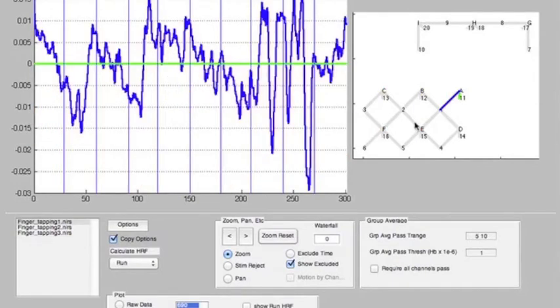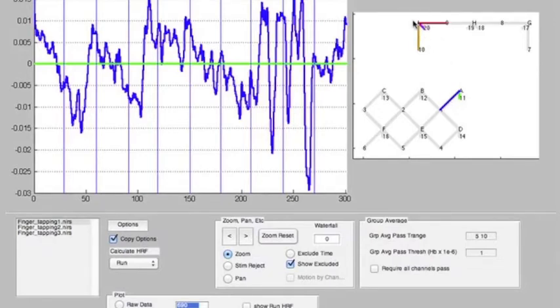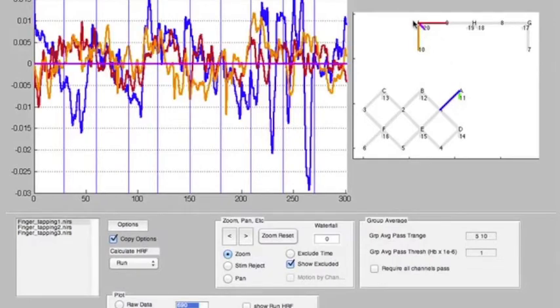If you want to see data from multiple different locations, you would shift-click, and that gives you data from all of those channels.